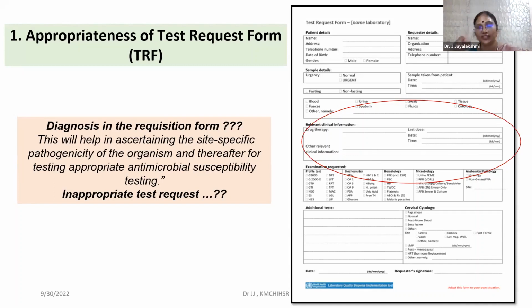Okay, the type of sample, and you tick the sample, additional information that may be there, and antibiotics that are given. Suppose it is a sample that does need to be collected. So the sample collector's name, date, and time are important. Why? Because we could go back to asking. At least the date and time, if not the name, but it would be good to have their initials so that we know whom to ask if there is a query.